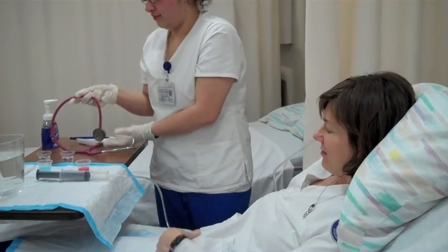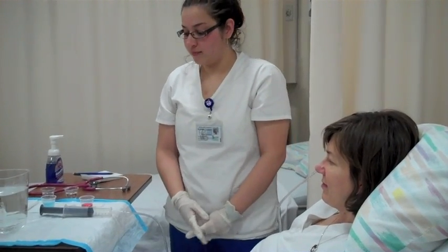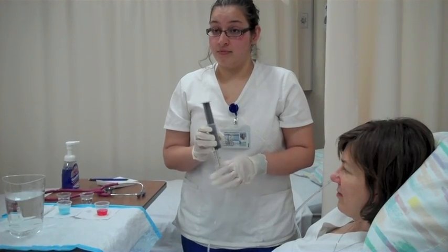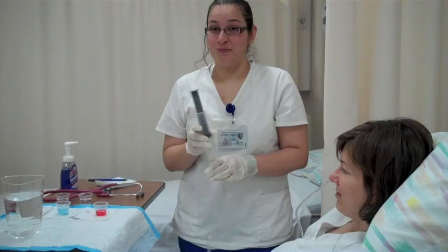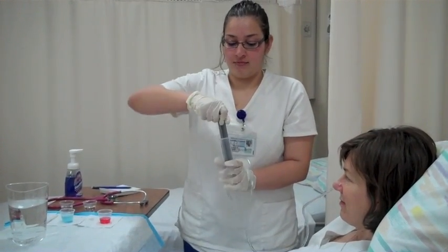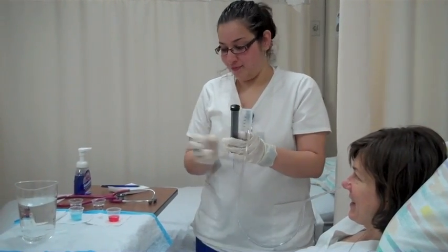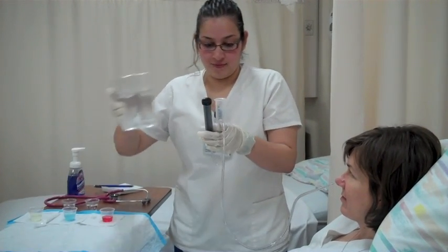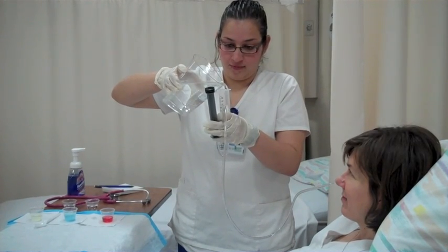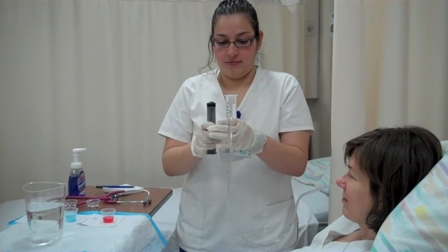Step 6. Before administering medications, it is important to flush the tubing to ensure patency. The steps to doing this are: connect the syringe to the tubing, clamp the NG tube, remove the plunger from the 60 milliliter syringe, pour 60 milliliters of water into the syringe, unclamp the tube and allow the water to enter the stomach via gravity infusion.